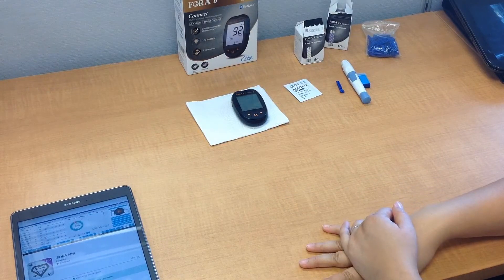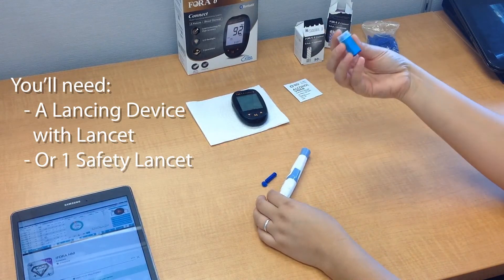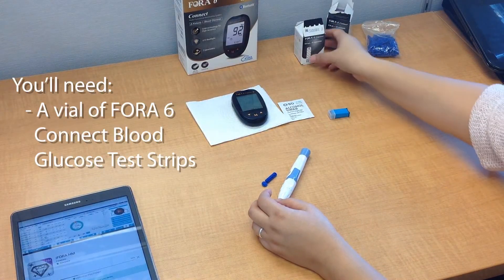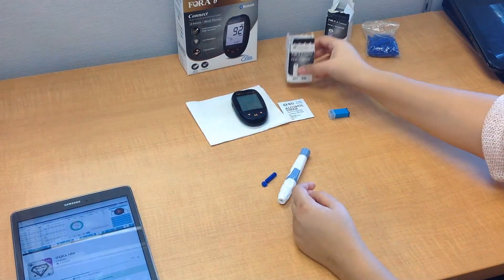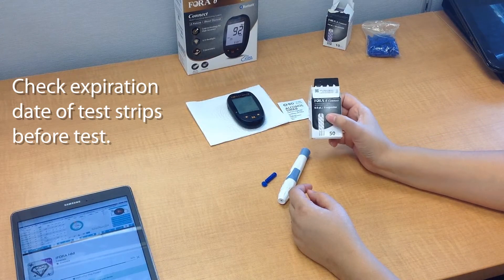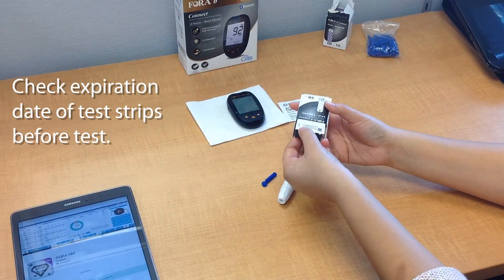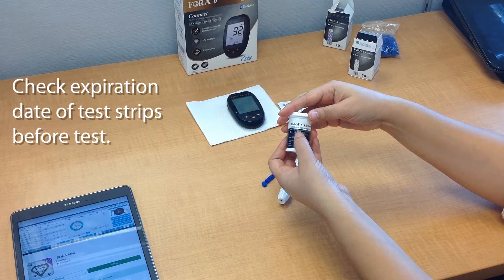Make sure that you have all of the required components for the test. You'll need a lancing device with a lancet or a safety lancet, an alcohol swab, a vial of the Fora6Connect blood glucose test strips, and of course your Fora6Connect meter. It's important to note that the strips do expire, so make sure that you're checking the expiration date prior to doing the test. You can find that either on the top of the box or on the vial itself.